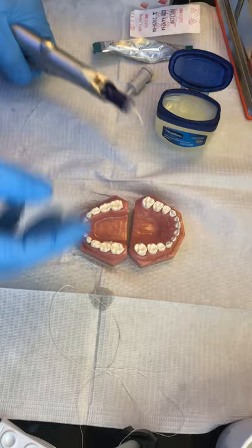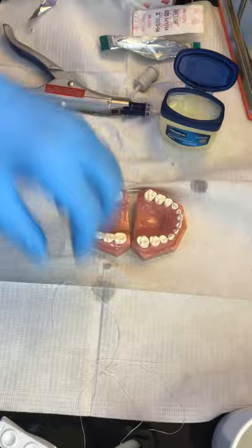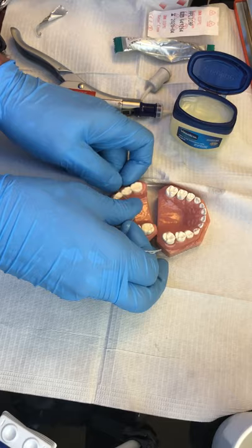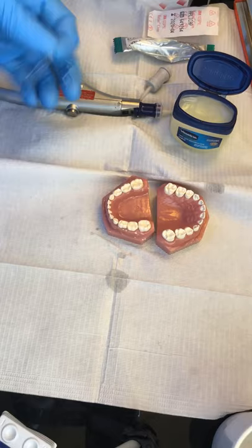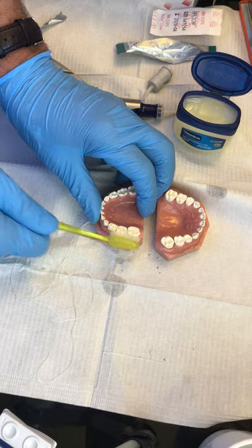Now I'm going to take moist cotton from my finger, remove the excess, and then we should really stop messing with it as soon as humanly possible. Is that really complicated? If you want to, you can go back to that toothbrush and get rid of the excess over here.